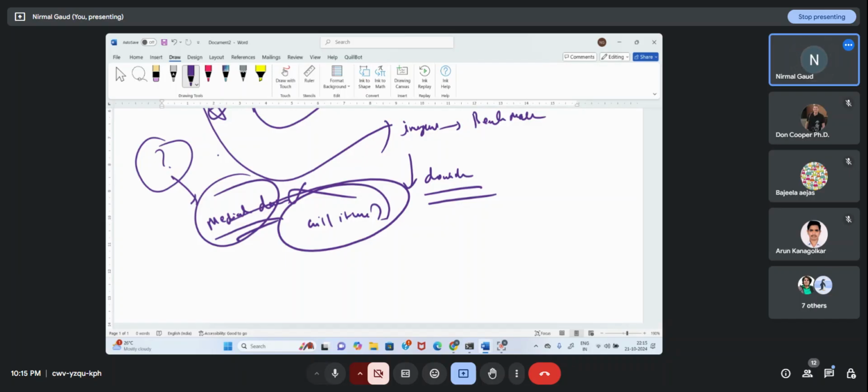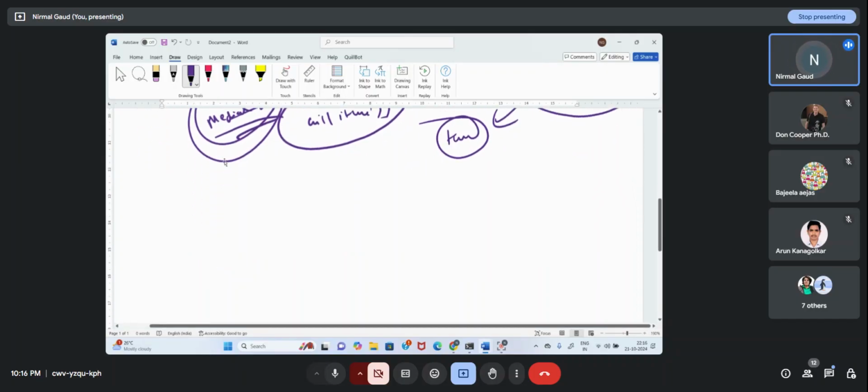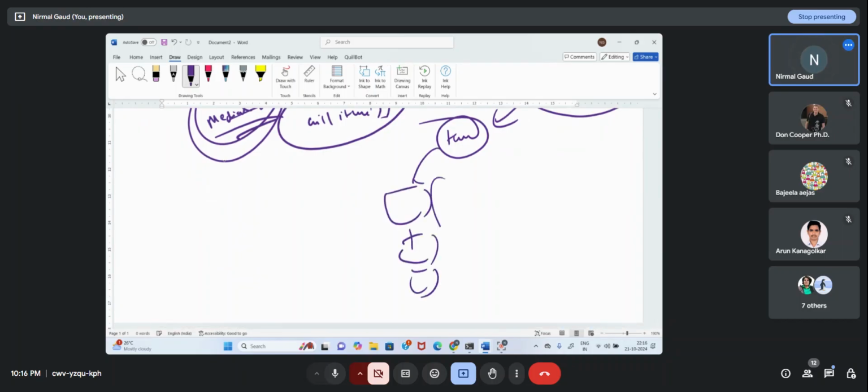See, here I am considering a model which understands images. Understands images means it has been trained over images. Whether it is of a person, dog, cat, horse, any other object, I do have an image. There are many classes, thousands of categories present in the ImageNet data set. Millions of images are present in the ImageNet data set. So my model does know about images. It does not have medical images, but it knows images. I can take its weights, and I can add a few layers in front of it, that is called transfer learning.